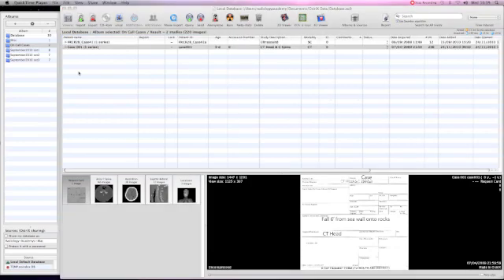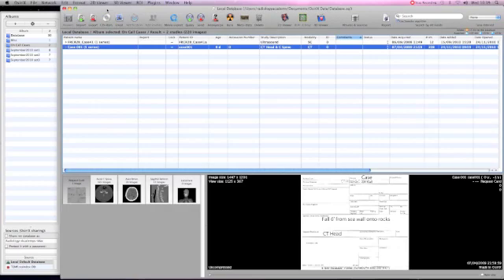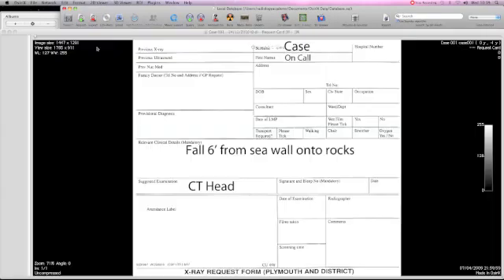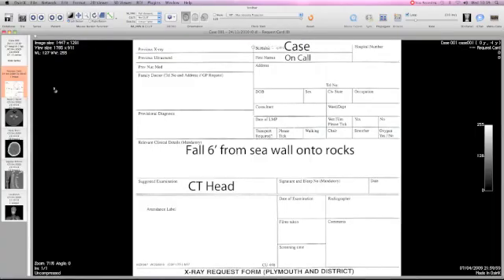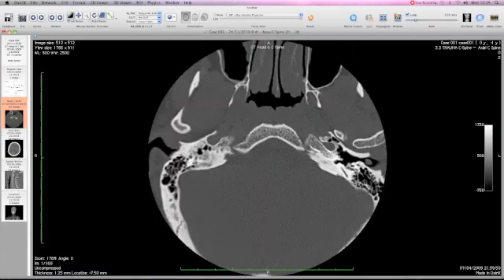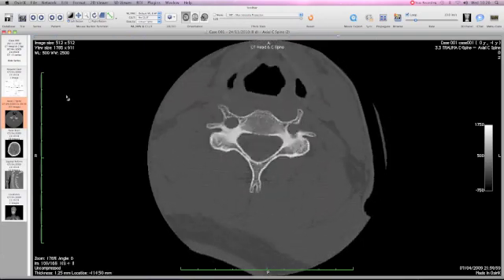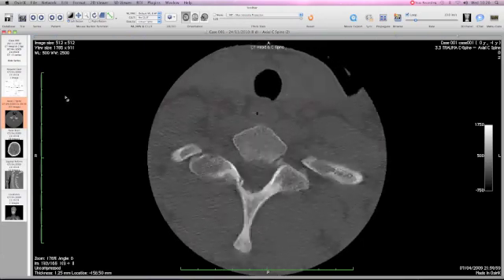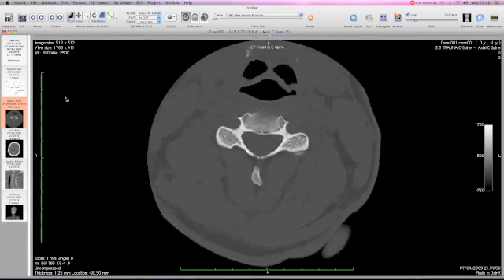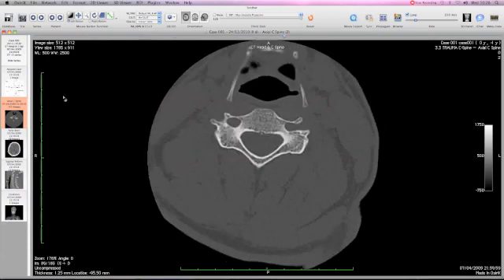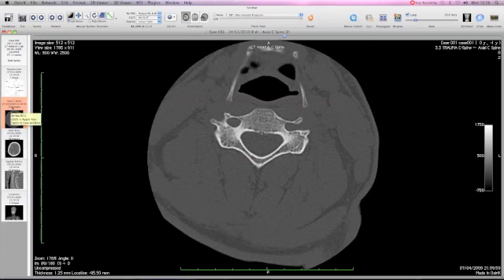We're now going to look at some basic editing functions that I found useful in creating teaching files. The first thing we're going to do is look at thinning down a series that's been imported. If we first look at the axial data set, we may want to firstly rename the data set. Secondly, we may want to reduce the number of sections and also clip redundant images at the front or back end of the data set. And this is how we do it.